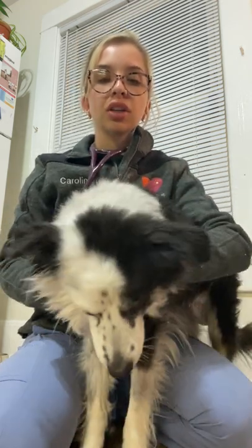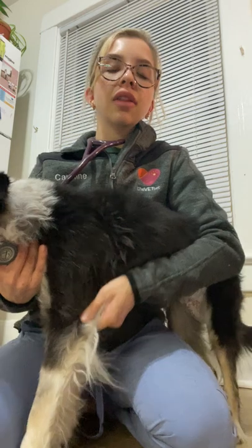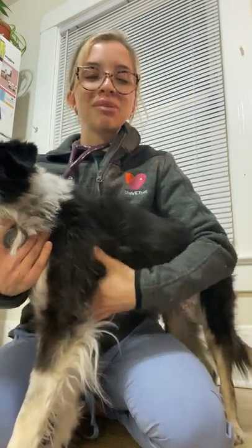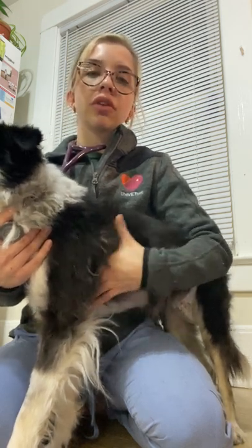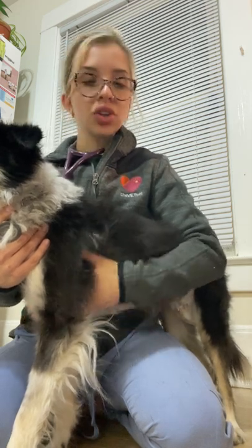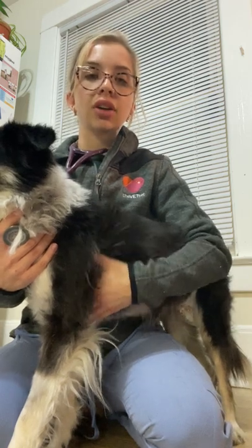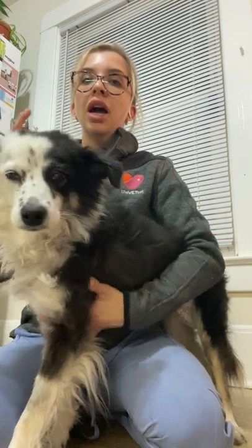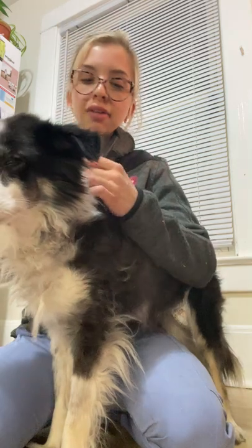With our patient we can actually go ahead and locate the heart by using the point of the elbow as a point of reference. I'm going to go ahead and place my hand on the left side and I'm going to feel for the cardiac impulse. Her heart is very strong, I can feel that very well, so this is going to help us find a good location to start listening to the heart. So I'm going to go ahead and start with our pulmonic valve.